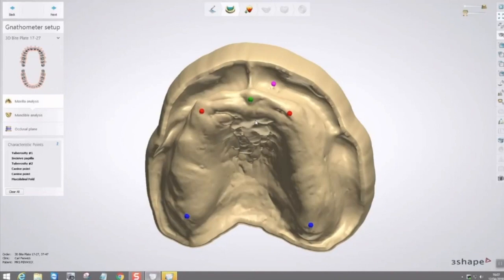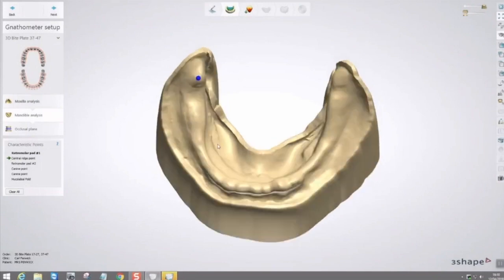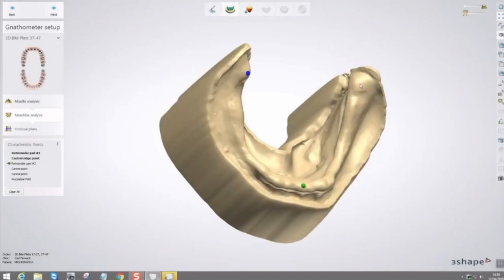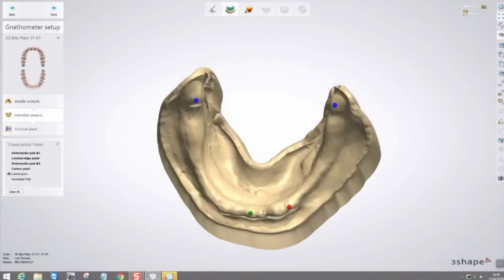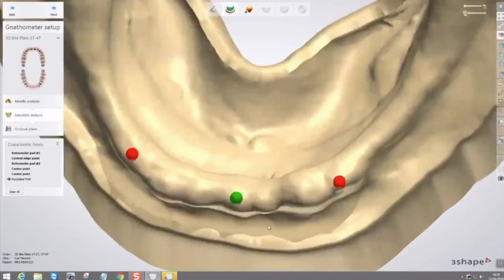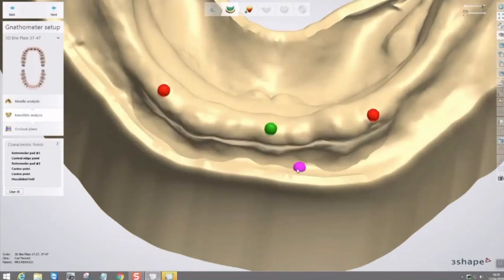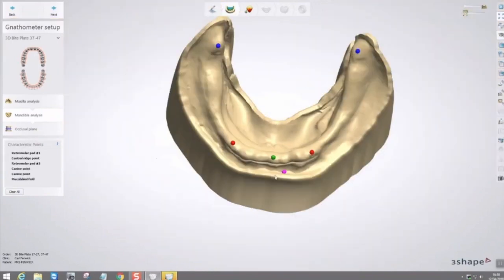We do the same on the lower, but with different anatomy: retromolar pads, canine points, mucolabial fold. Just click click click — it takes seconds. For those familiar with 3Shape, this is second nature; it's the same intuitive interface, just the denture side of the software.